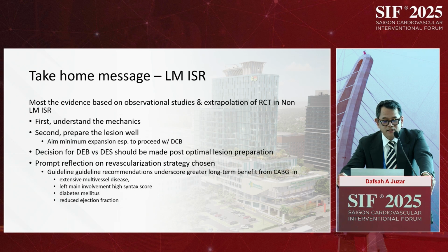And the take-home message is that most evidence is based on observational studies and extrapolation of RCTs in non-left main ISR. First, understand the mechanics. Second, prepare the lesion well. Aim for minimum expansion, especially when you proceed to DCB. And the decision for DCB and DES should be made post optimal lesion preparation.